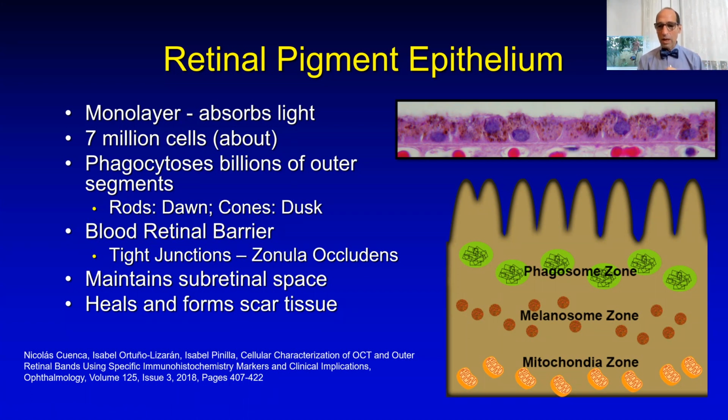The one thing that's not yet in common nomenclature is when you look at an RPE cell, the mitochondria segment to the back of the RPE cell, and then the phagosomes, which are what eat all your buildup from all the billions and billions of outer segments the RPE cells are trying to digest, are on the superficial layer. And there's some recent papers suggesting that those are the bands that we see on OCT scan, the two bright bands. When we look at the RPE cells, there's two bright bands. There's an outer band and an inner band. And it's probably the phagosomes, but for textbook purposes, it's actually the interdigitation zone. And we'll hit that in a couple minutes.